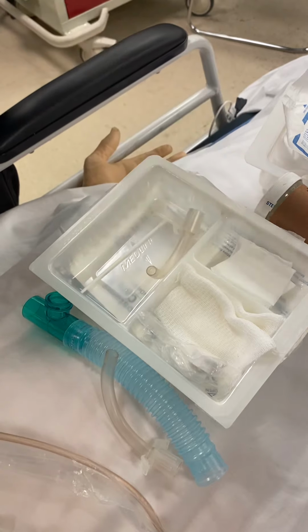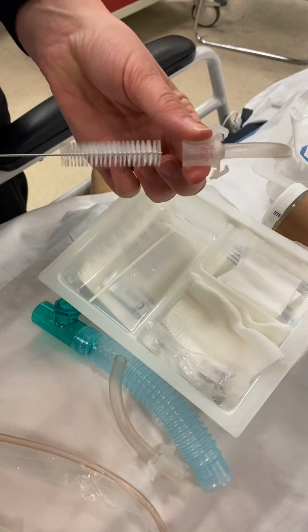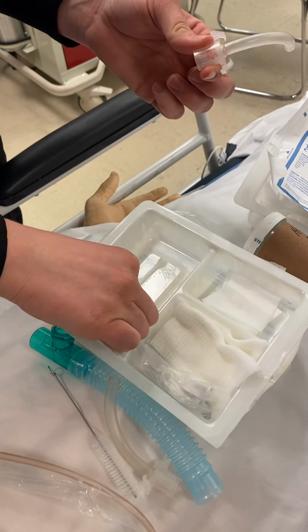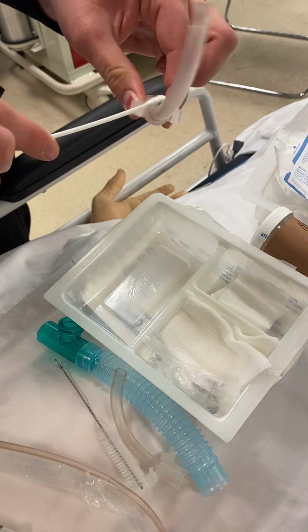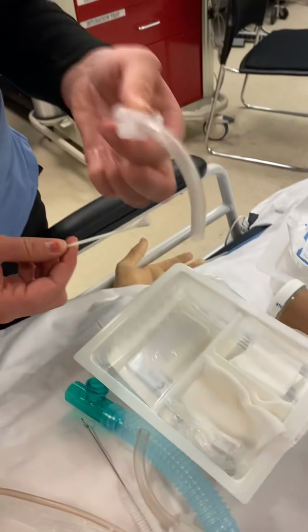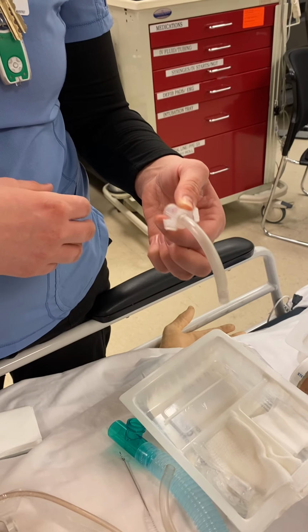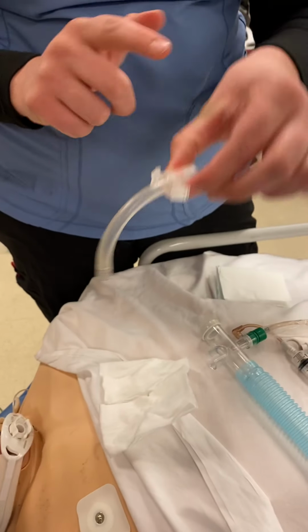Okay, so you're going to drop it in your solution. You're going to take any brushes and you're going to clean and twist, going all the way down, getting any junk, blood, or secretions out of that line, okay? You can also use Q-tips to clean around it. And you want to get kind of aggressive and get this really nice and clean because this is their airway. So if it gets clogged or occluded with any blood or secretions, that patient's not going to be able to breathe. When you're putting it back in, be mindful to only touch this top part.